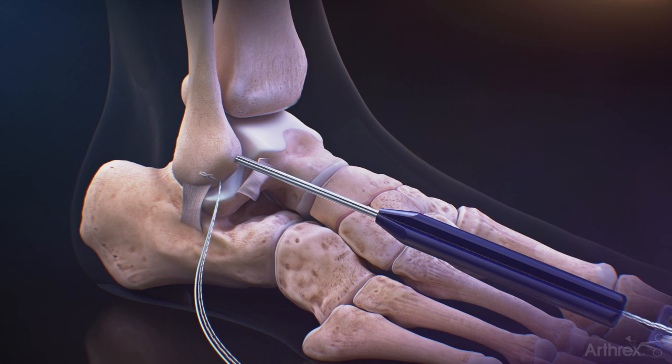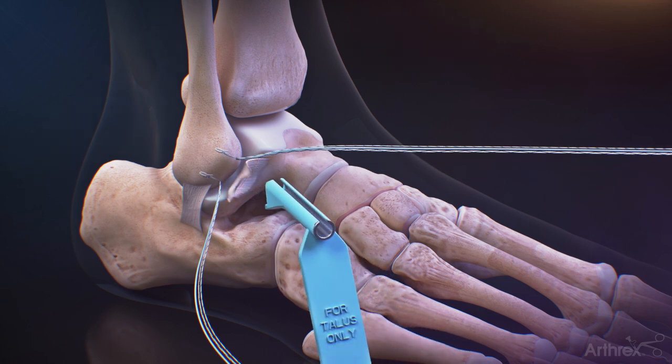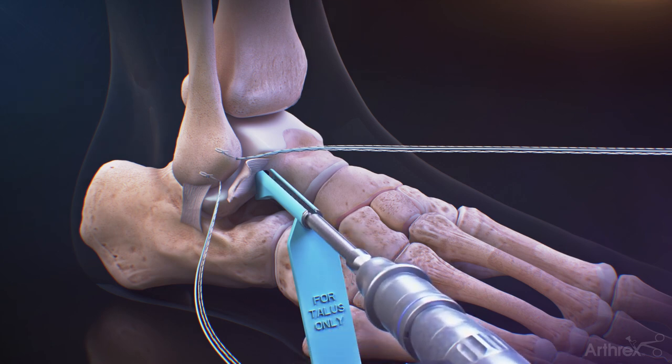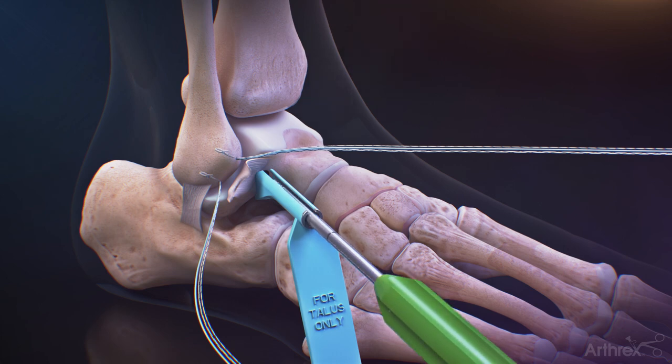Repeat the steps for the second anchor location. Introduce the 7 mm talus offset guide into the sinus tarsi and flush against the talus. Drill with the 3.4 mm drill bit and then tap with the 4.75 mm tap.